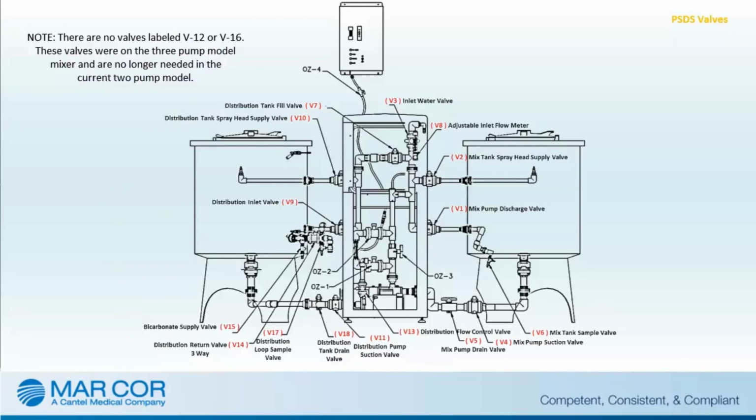Detailed step-by-step instructions for daily operation of the PSDS are included in Chapter 3, the System Operation chapter of the PSDS Operation and Maintenance Manual.